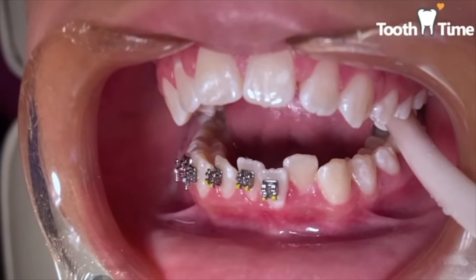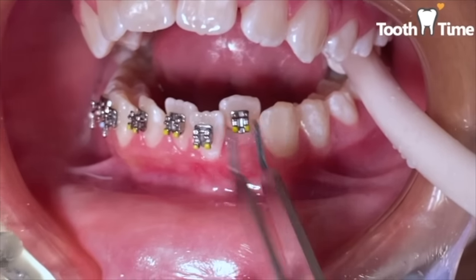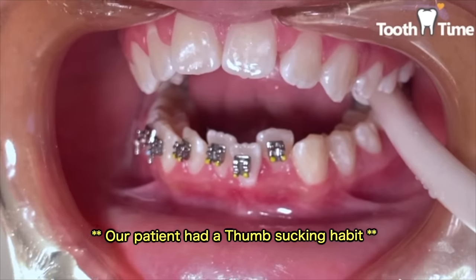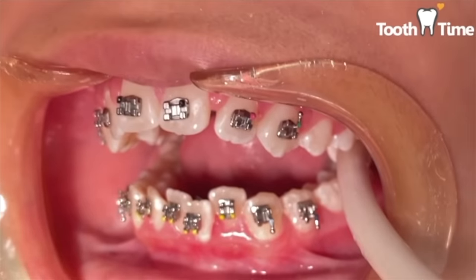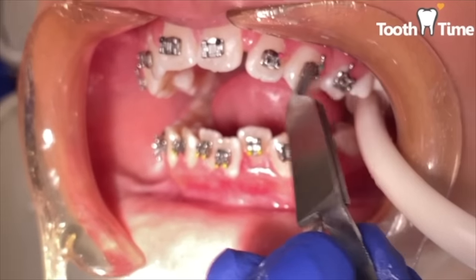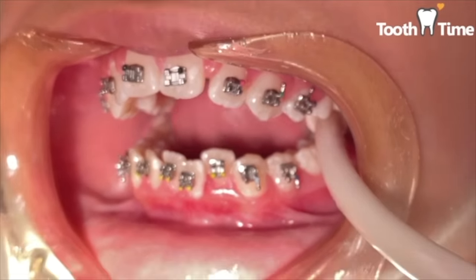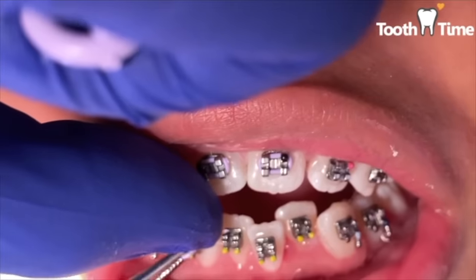So a tongue crib appliance is an appliance that goes on the top of your palate. It's usually used for someone who has a bad habit of sucking their thumb or tongue thrusting. Tongue thrusting is usually when you bite down and swallow, and you push your tongue against the back of your front teeth. Usually that appliance, a tongue crib, will help avoid or prevent that bad habit.